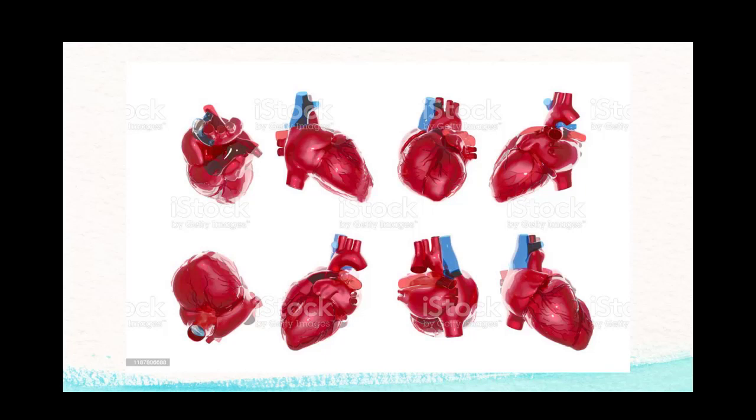And this is a picture of our heart in different viewpoints. So our first viewpoint is looking at the very tip top of the heart where the aorta comes out. And next, we're looking at the position that it would be in the body. And then third photo, we're looking at closer to the bottom part of the heart. And then we're rotating that heart through different images. Now, we are looking at, with EKGs, electrical pictures. This is a picture of the electricity as it's running through the heart.